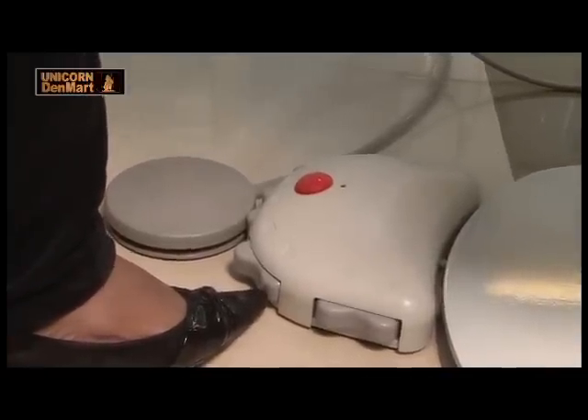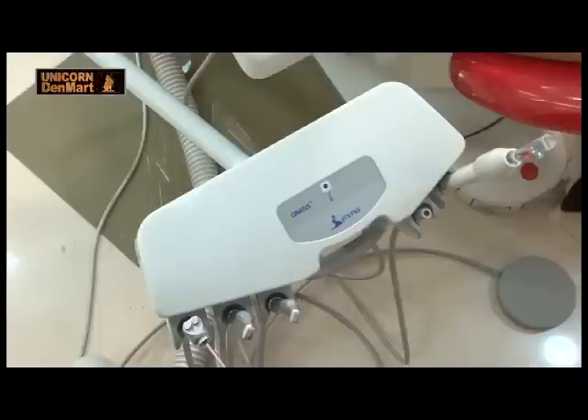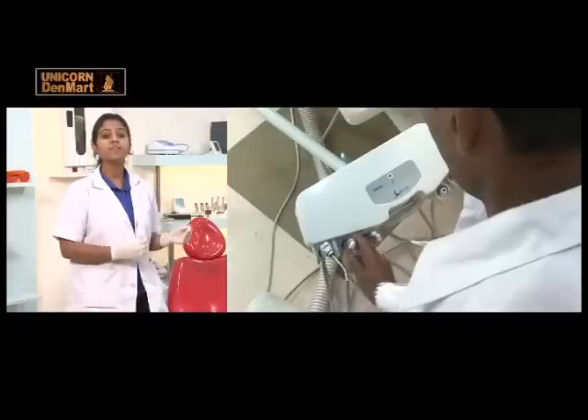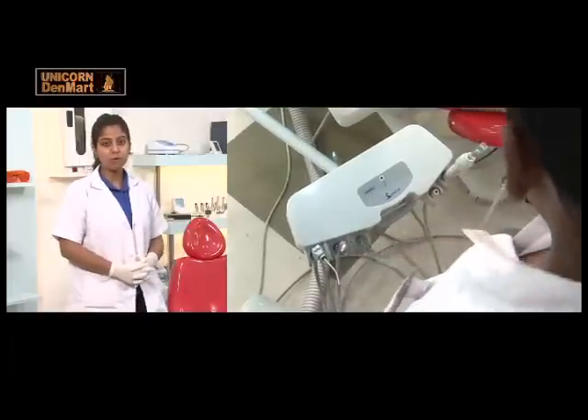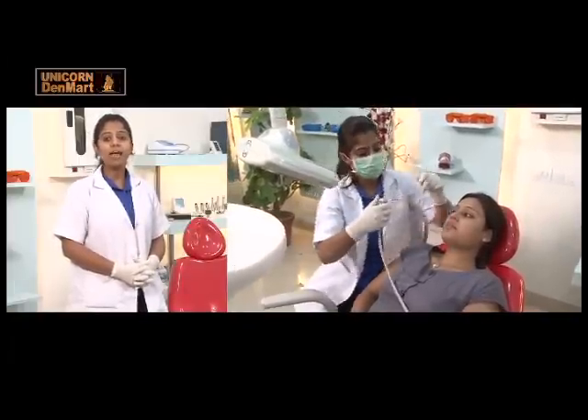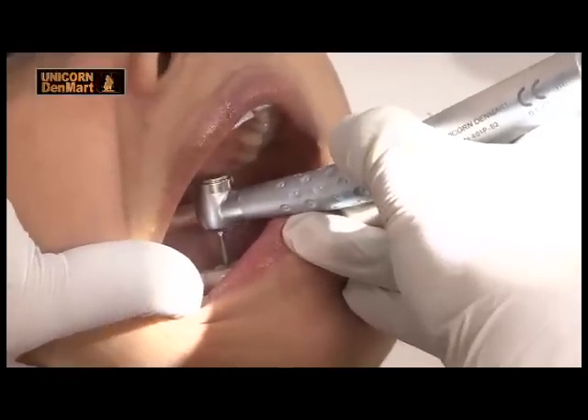The chair comes equipped with five inbuilt programs. It has all attachments on the assistant side, providing greater accessibility to the orthodontist for complete dental treatment. The assistant side has a bio system, preventing cross contamination by saliva or blood access through the handpiece.